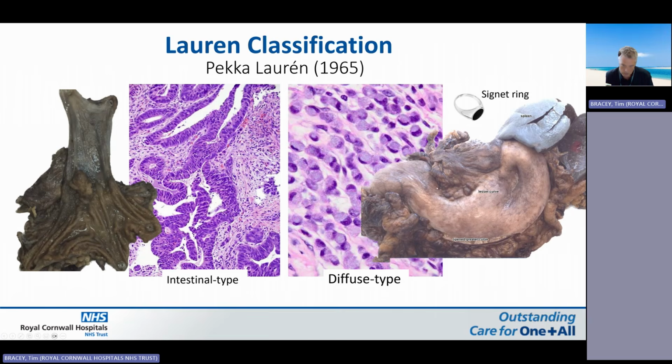This is the incisura, which is the highest risk area for adenocarcinoma, and it's very hard for the surgeon to even find where the tumour starts and stops, and similarly difficult for the pathologist as well.